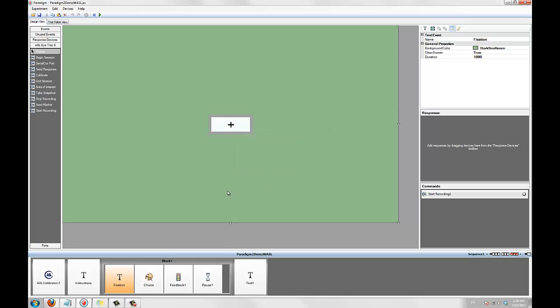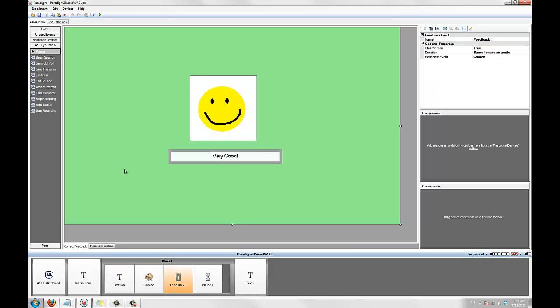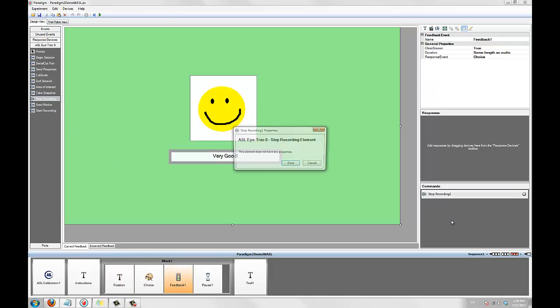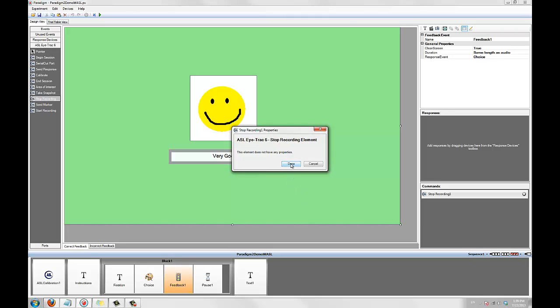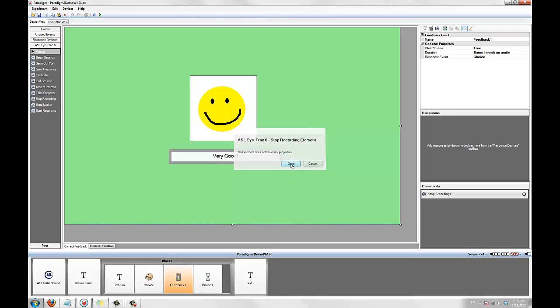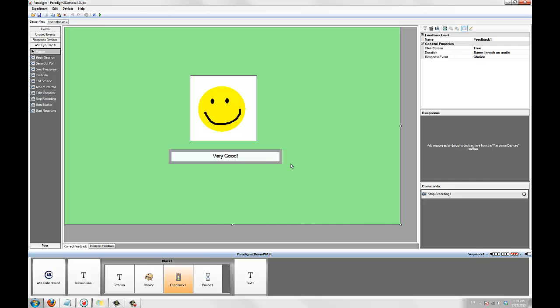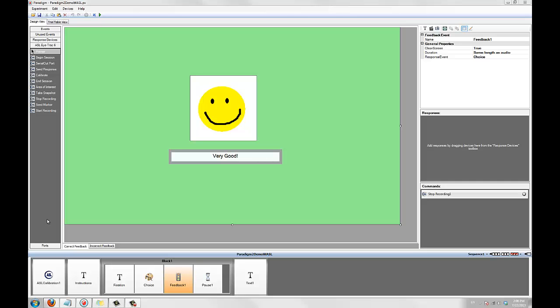Next, we'll add a stop recording element to the feedback event. This will stop IData recording at the end of each stimulus presentation. You'll typically want to start and stop recording this way because it will cut down on the size of the data file you'll have to analyze. And if you are using ASL results, it will also allow you to easily segment your data.